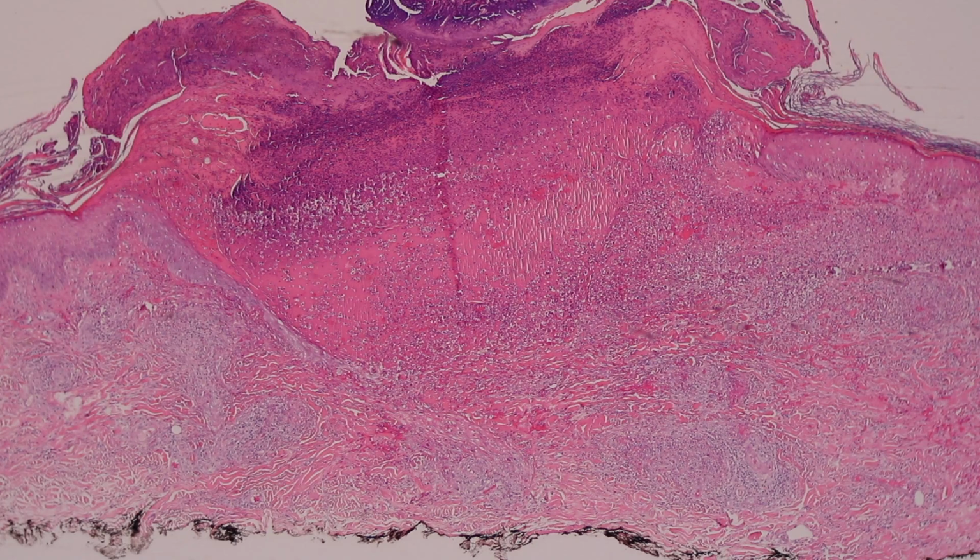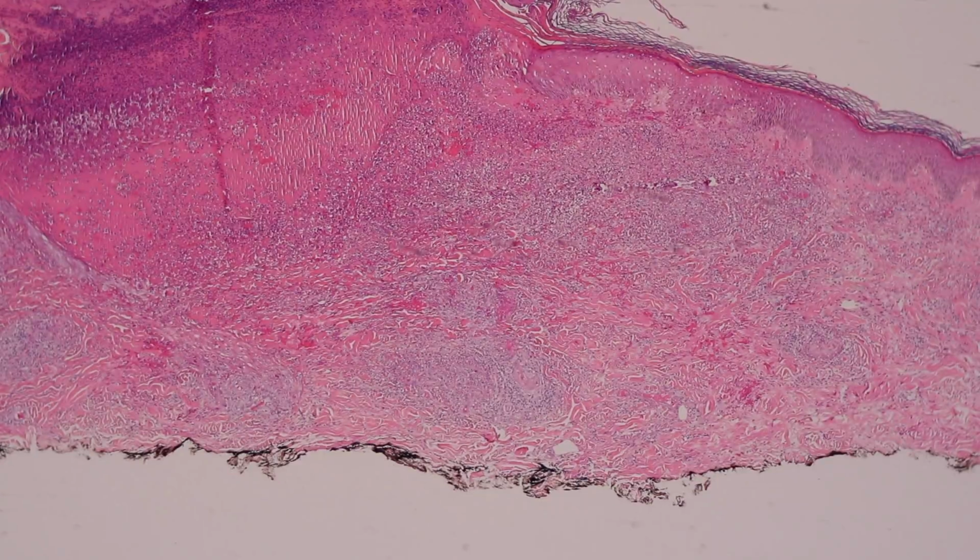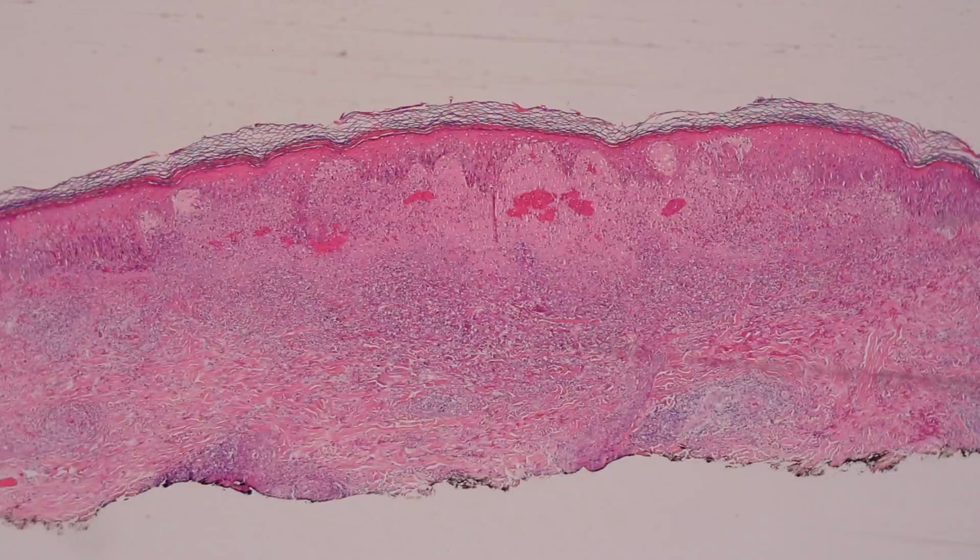I've found multiple times where that's really been helpful, not only in the setting of vasculitis, but also if you're looking for a tumor that might be deeper, and also if you're looking for, say, calciphylaxis or some other process that generally involves the subcutis mostly. Getting a double punch is a good thing to do if you don't have the ability to do an incisional biopsy. So again, this is an example of bullous leukocytoclastic vasculitis that's actually ulcerated and ruptured.